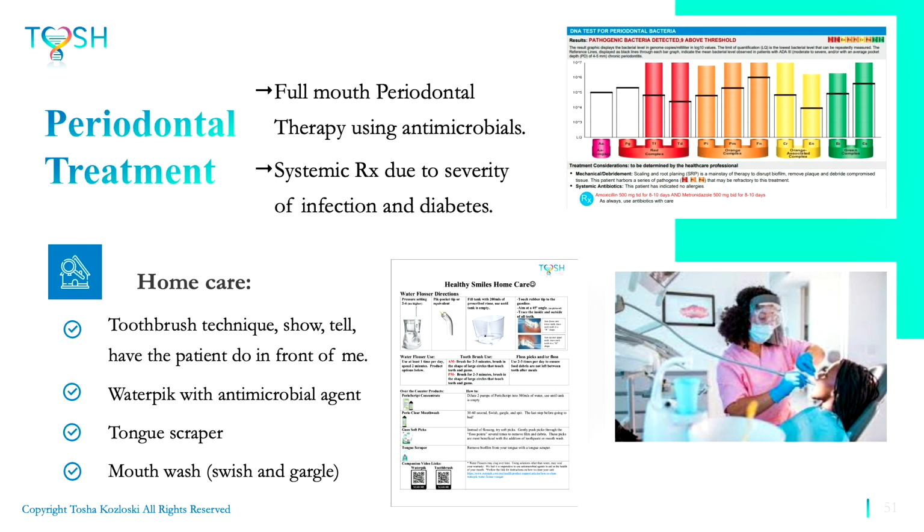Now, this particular test is MicroBlink and DX, and they will give you a suggestion for antibiotics. Not everyone needs antibiotics. It'll put out antibiotics far more often than is needed, and it's up to the doctor's discretion whether or not you ever want to use them. In this situation, the doctor did elect to do metronidazole simply because she had had periodontal disease for so long. She was diabetic, and she had a 9mm defect. So really, the goal was just to clobber this infection.